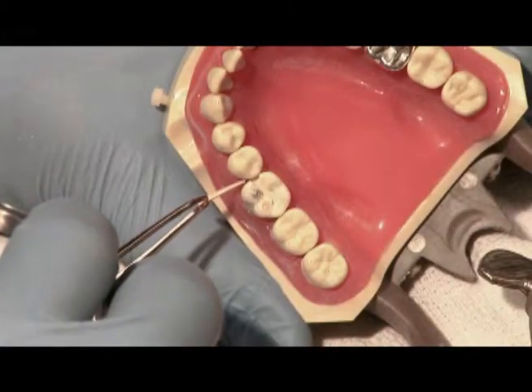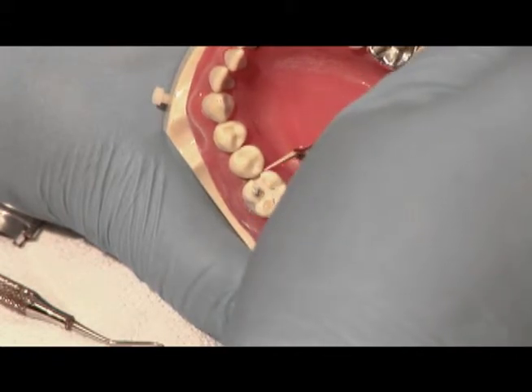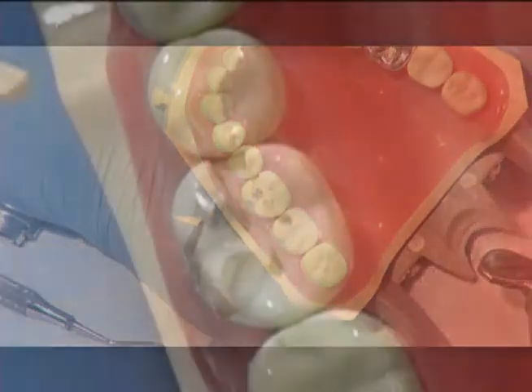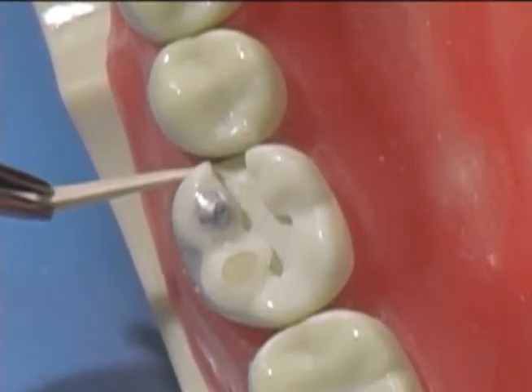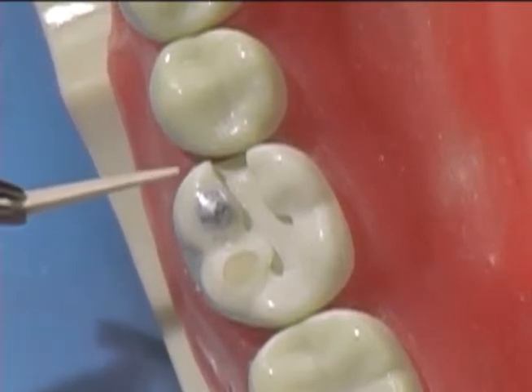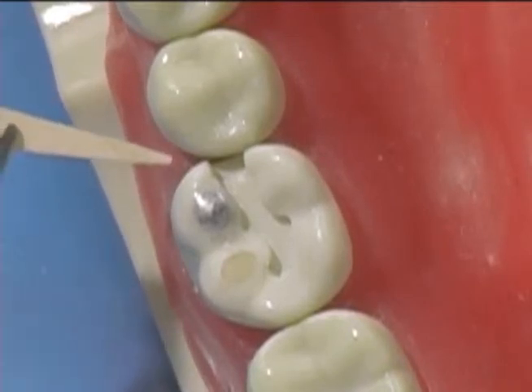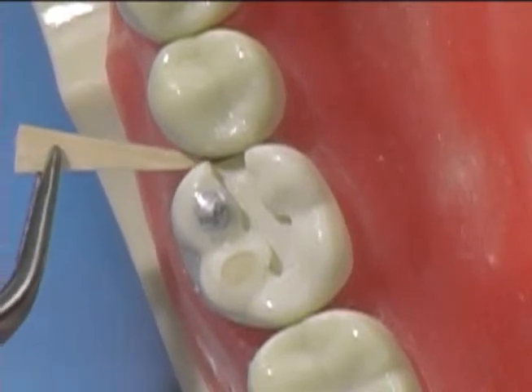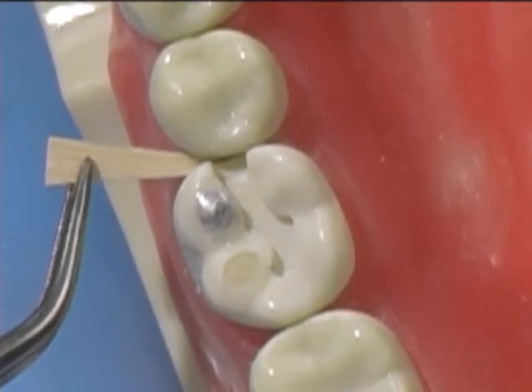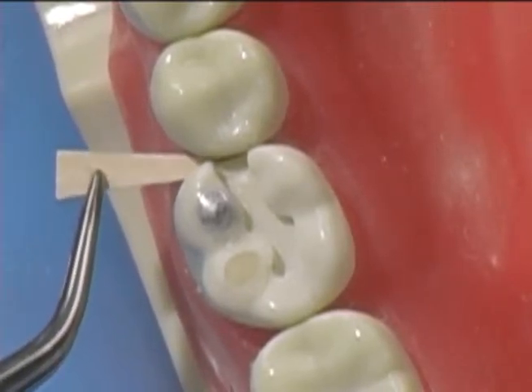If we had a situation where this preparation space was greater on the lingual side, then it would be appropriate to place the wedge from the lingual. So preparation distances between the proximal box and the next tooth help to determine not only which side we wedge from, but how thick the wedge should be. If the wedge needs to be thicker in this case, we might change the wedge to an angle where we use the wider portion of the wedge and hold the band up more tightly against the gingival of the tooth.